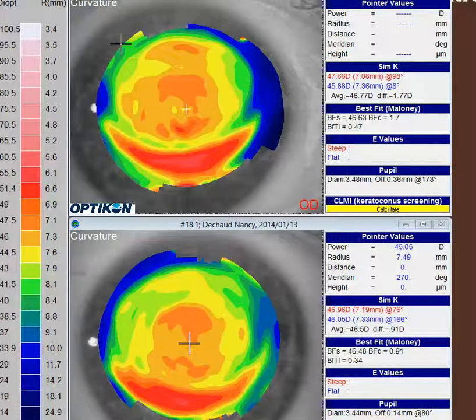Well if you look at your topographies, I think the difficulty is probably this lower steeper cornea as you thought. I agree with that and what's probably happening because it's a little steeper down here, you've got this flatter superior quadrant so those lenses are just kind of riding down this slope of the mountain so to speak and lingering up top here.